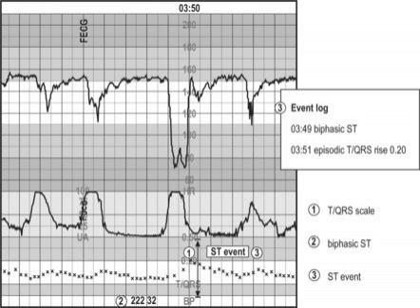In obstetrics, we rarely get sued or face upset parents for doing a cesarean delivery and presenting them with a healthy baby. But we do face issues for the opposite. So the natural pressure on the provider at the first sign of quote unquote distress is to intervene. So you would think that anything that reduces the false positive rate of fetal heart rate tracings would be welcome. And that is why I find it so interesting that the overall section rate didn't change with the pulse ox.